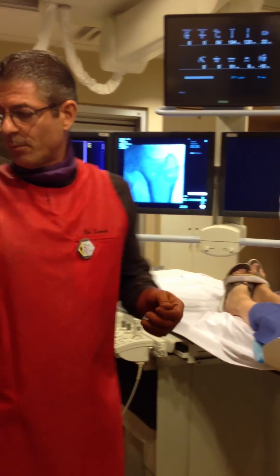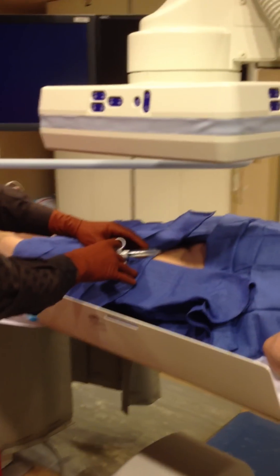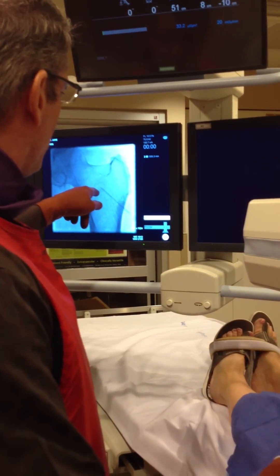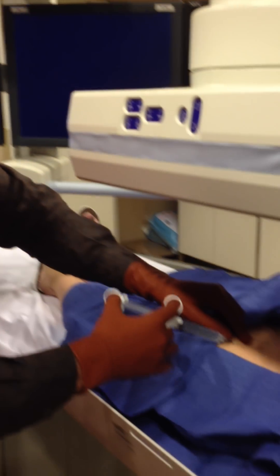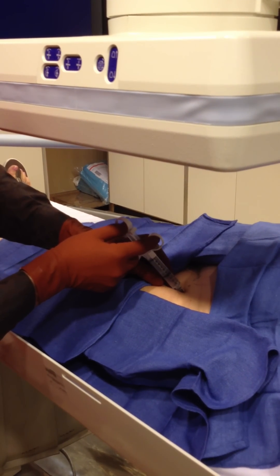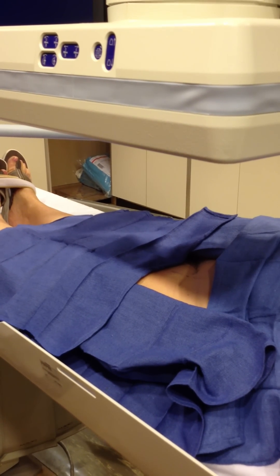We usually add a little sodium bicarb — 9 cc's of the lidocaine, 1 cc of the sodium bicarb. A little fluoro. That's about where I'm going to start. So then I make a little entry, just right there, pinching the skin to get the skin numb. I usually just go down and get the muscles numb. You don't always have to worry about getting it all the way to the bone — depends on size of the patient. Sometimes you'll get it all the way to the bone, sometimes you won't.